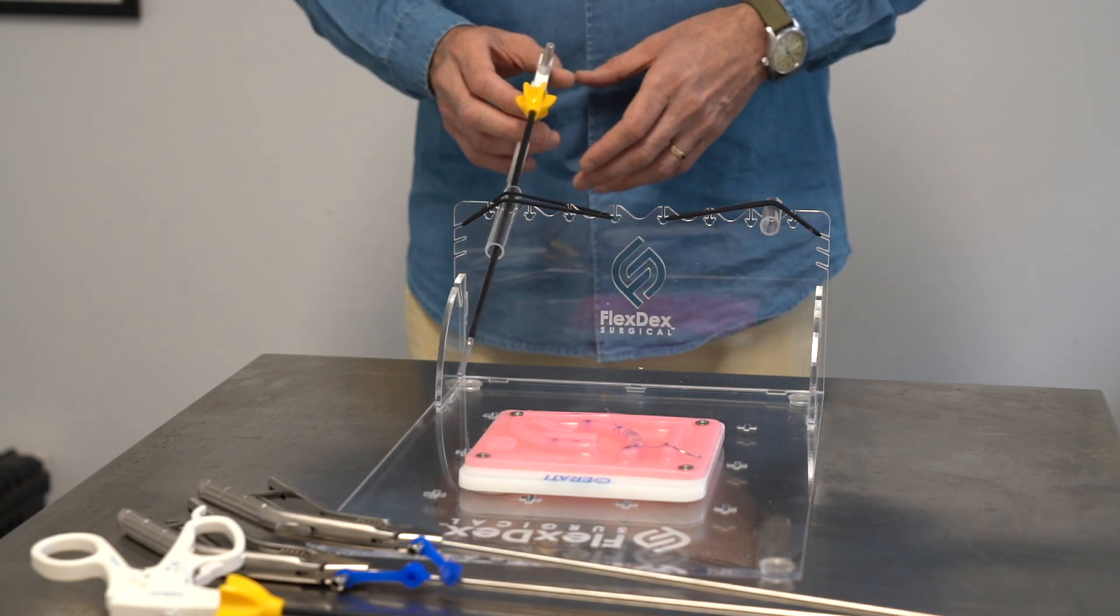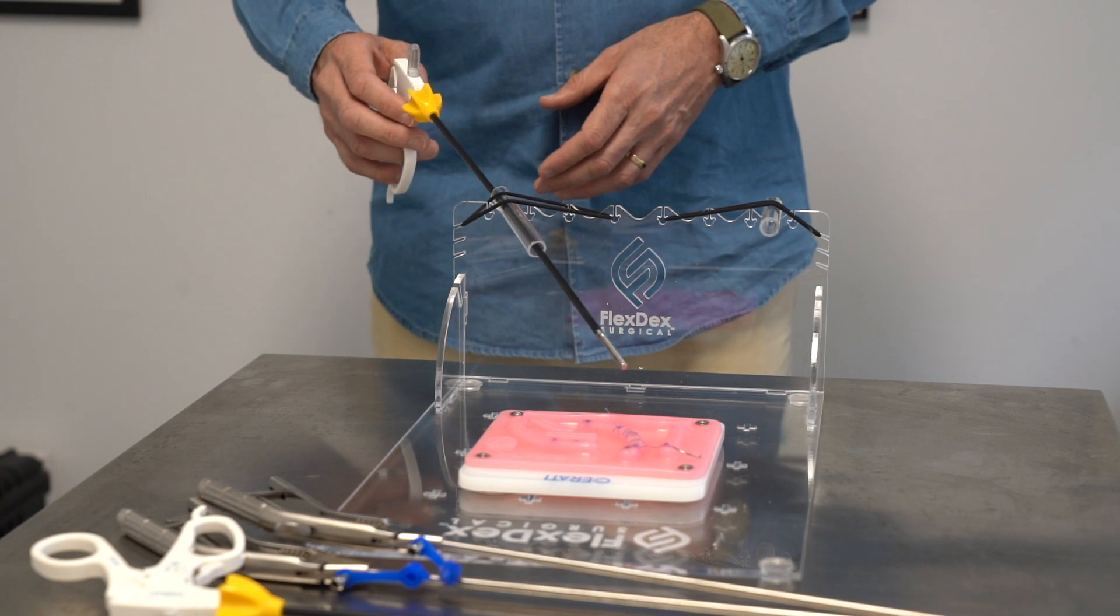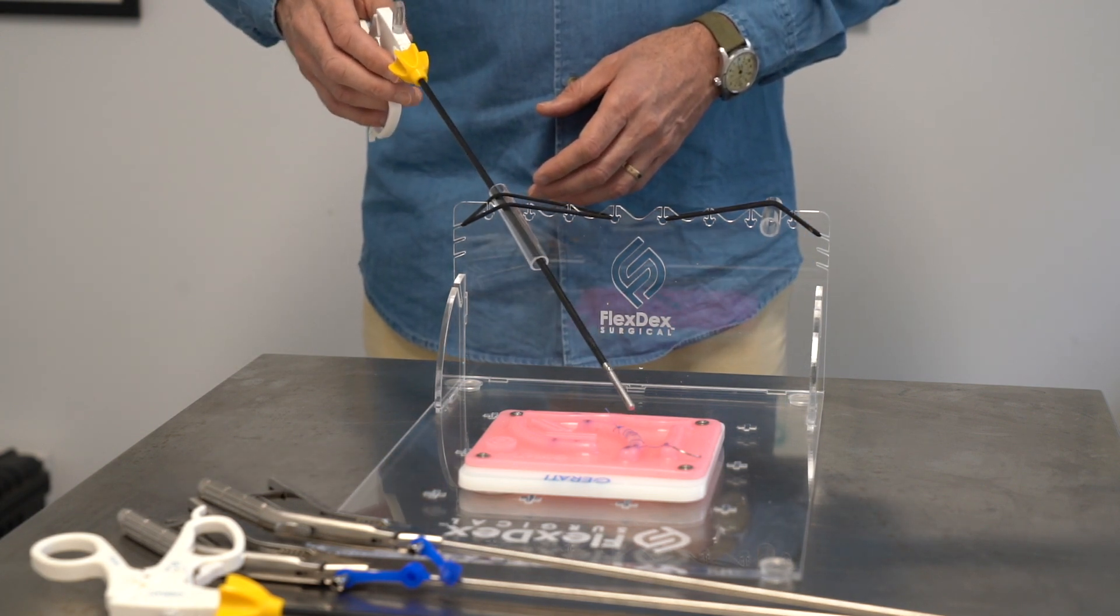For example, if you want to move to the left inside the abdomen you have to move your hand to the right. If you want to move down inside the abdomen you have to learn to move your hand up.